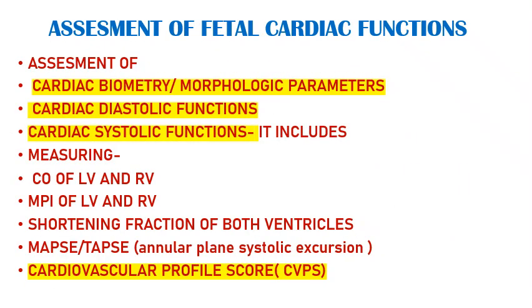Now, which cardiac functions are to be assessed? These are cardiac biometry, cardiac diastolic functions, and cardiac systolic functions, which include cardiac output, MPI, shortening fractions, MAPSE-TAPSE, and finally cardiovascular profile scores.